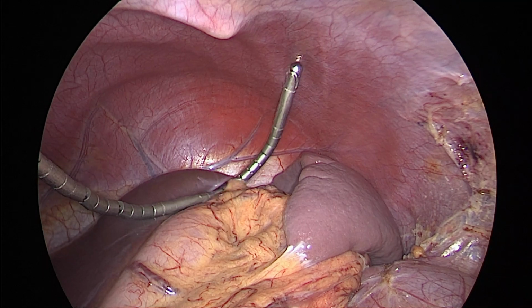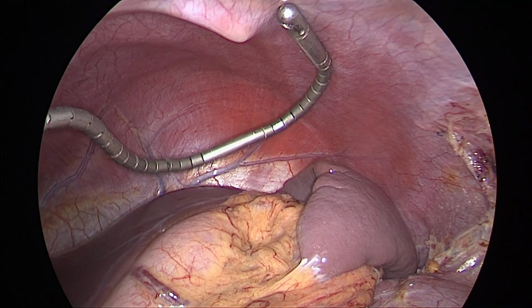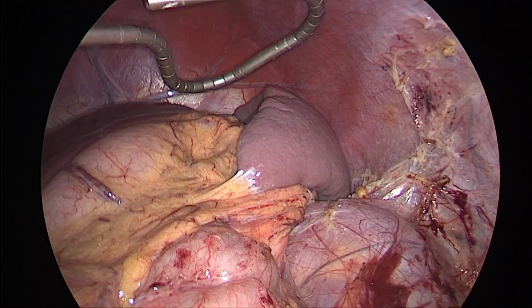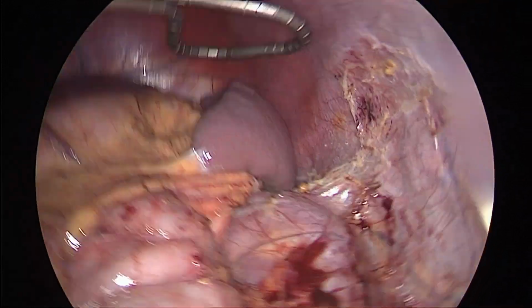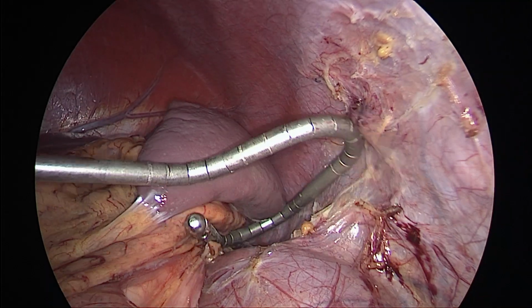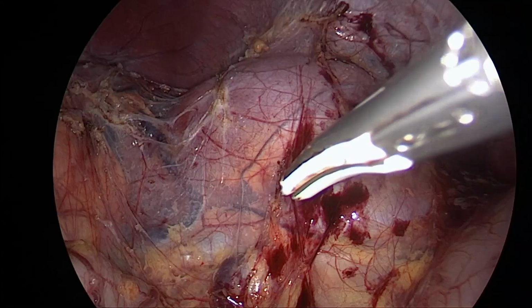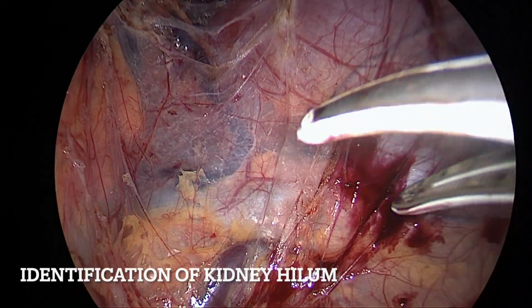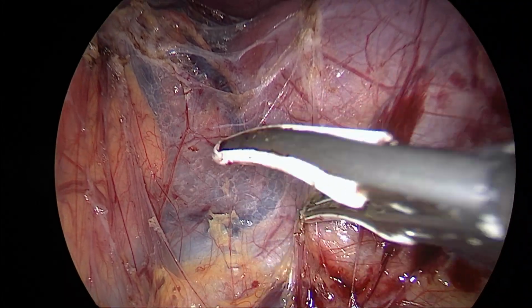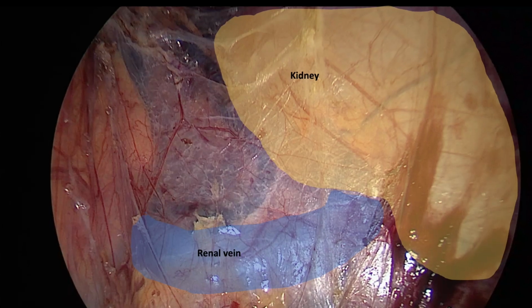Then the before-mentioned fourth trocar was inserted for retraction of the spleen, hereby creating a soft tension on the remaining tissue covering the kidney hilum. The identification of the hilum and suprarenal vein is crucial for the further steps of preparation.